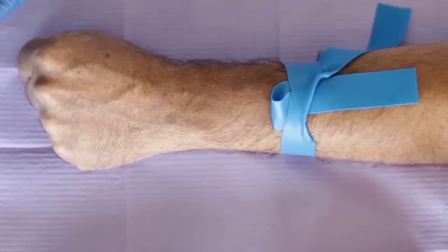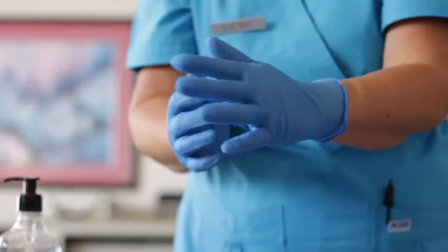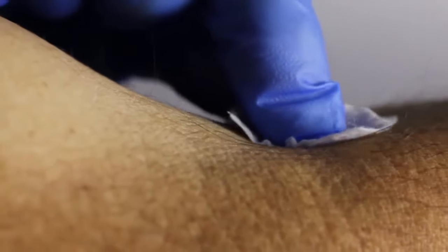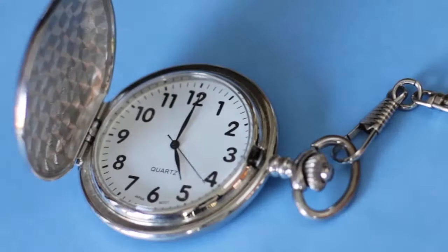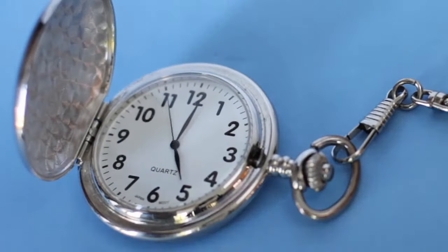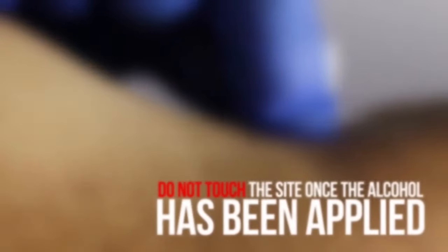Don't ask the patient to pump the fist. Don clean, non-sterile gloves. Disinfect the site using an alcohol prep swab for 30 seconds. Allow it to dry completely for 30 seconds. Do not touch the site once the alcohol has been applied.